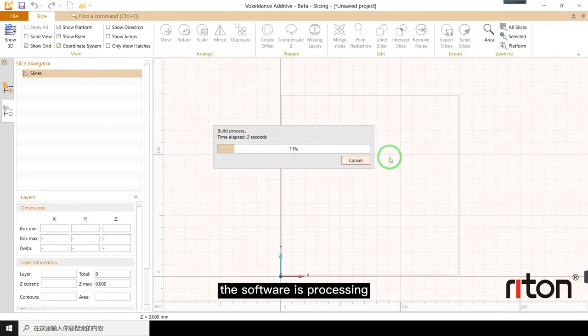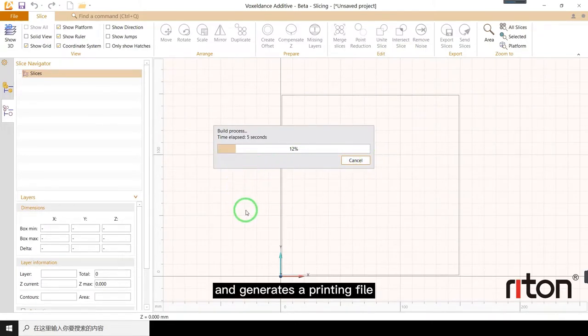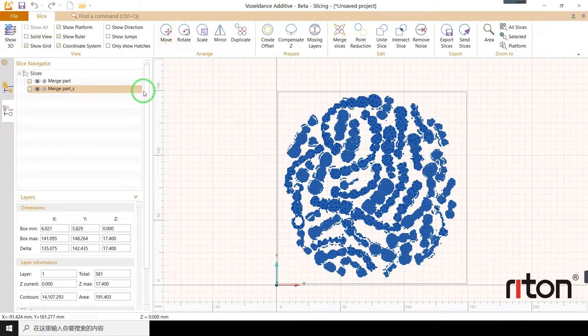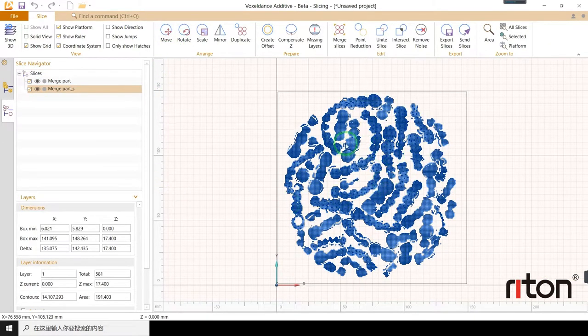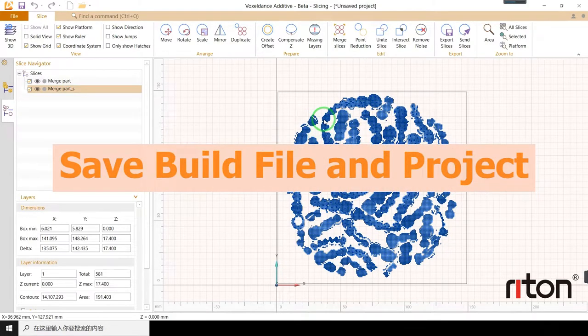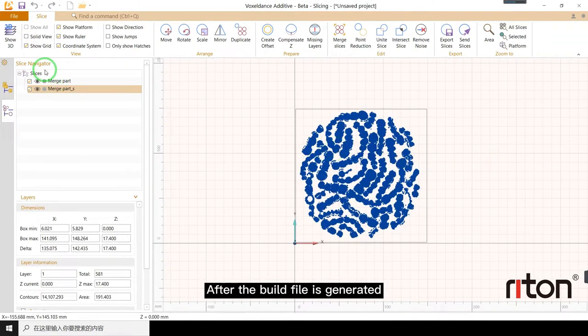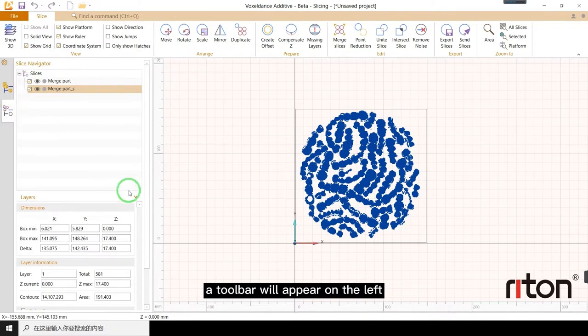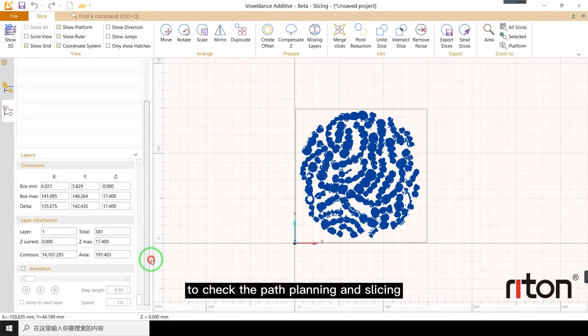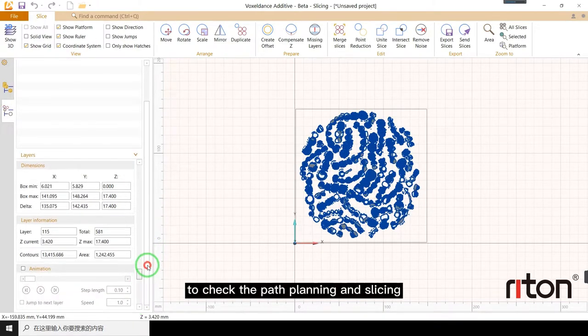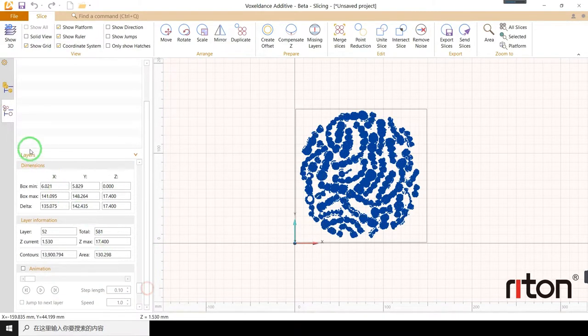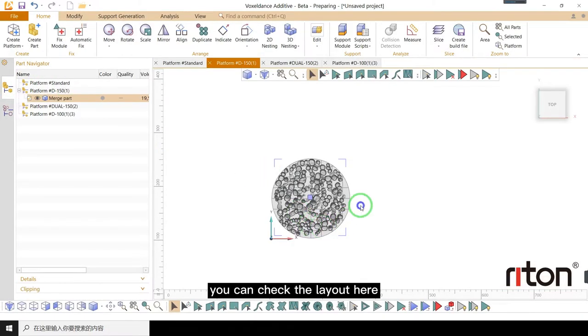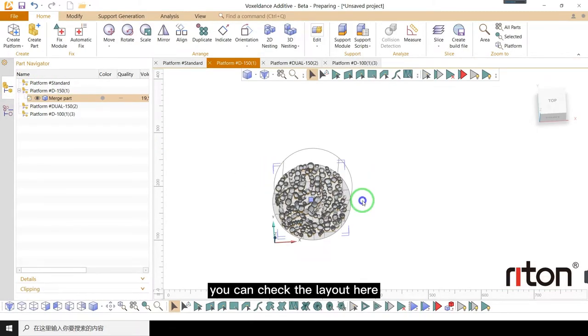The software is processing and generates a printing file. After the build file is generated, a toolbar will appear on the left to check the path planning and slicing. You can check the layout here.